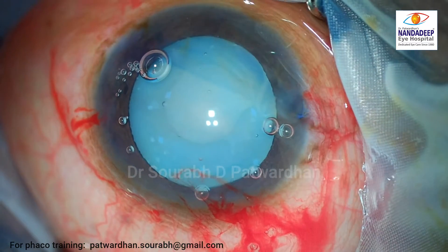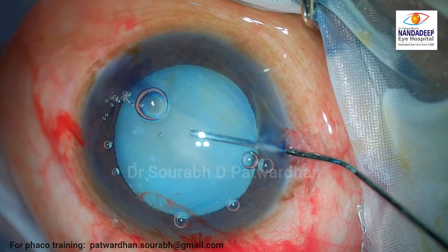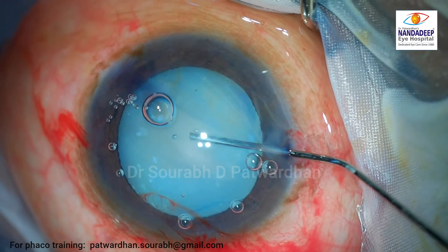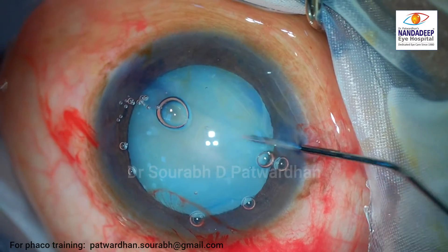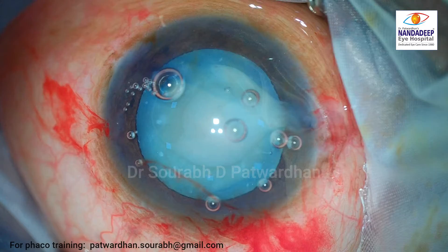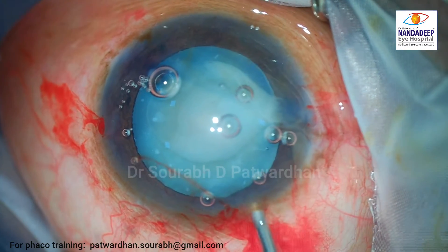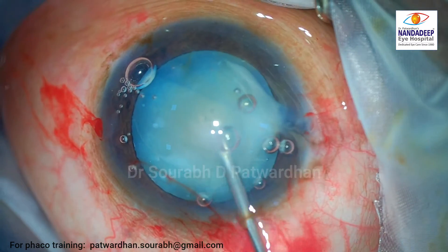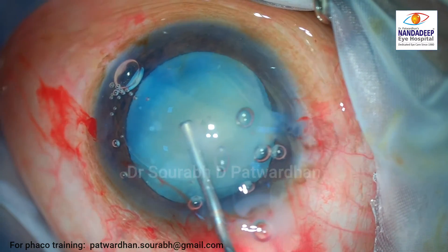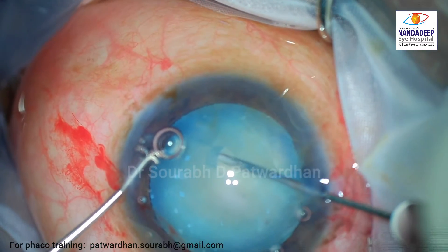Once the nick is made on the anterior capsule, you can see the fluid coming out. You can see some calcific spots on the anterior capsule already. Most of the epinucleus is liquefied and it keeps coming out. This whitish fluid is dispersed using OVD, and this is not an intumescent cataract.